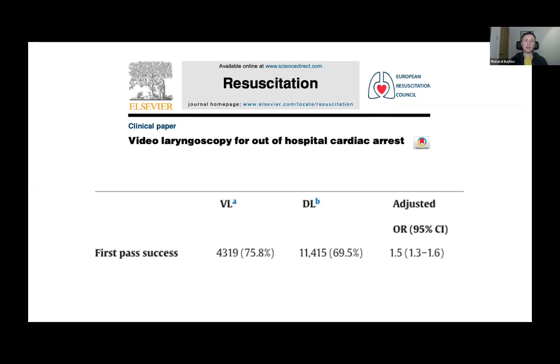from our own. So I'd be particularly concerned about that low first pass success rate in direct laryngoscopy. That doesn't really equate with the skills that we expect in our own practice in our own organisations. It's concerning that this repeated issue in the literature may well have affected the outcome of the Cochrane review. And the other feature that limits the applicability of these to our own practice is that in pre-hospital practice in other countries, and even within the US, the definition of paramedic changes quite significantly.